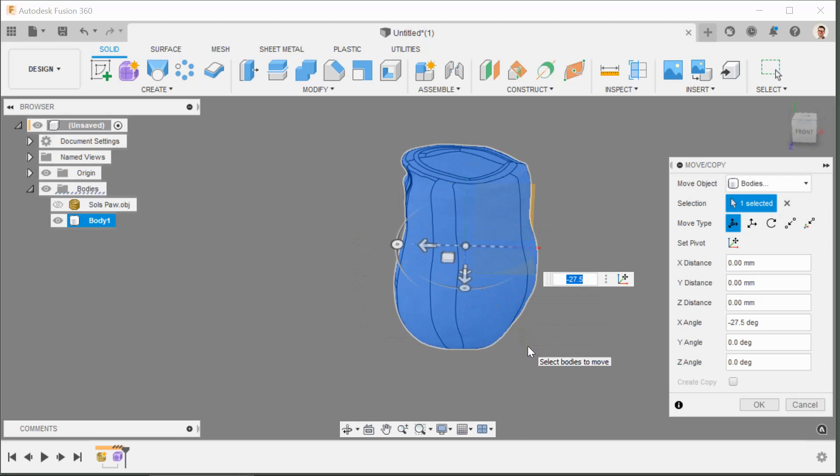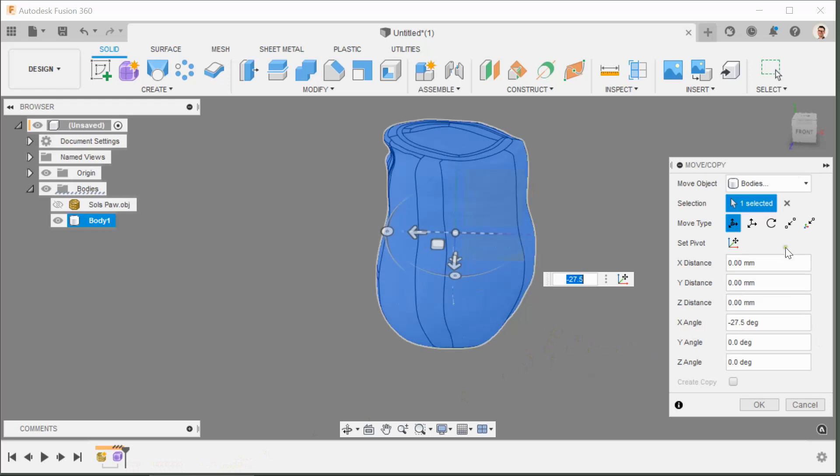Right, and remember that this is being captured in the design tree, but everything that happens with all of these movements now will be tracked by Fusion's history tree. Right, so let's get back on with twisting this into its final position.